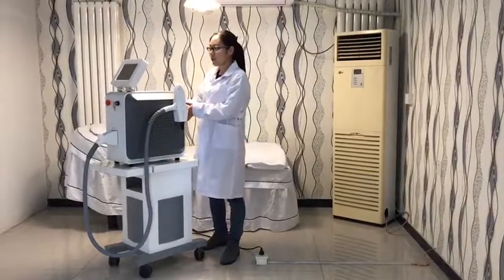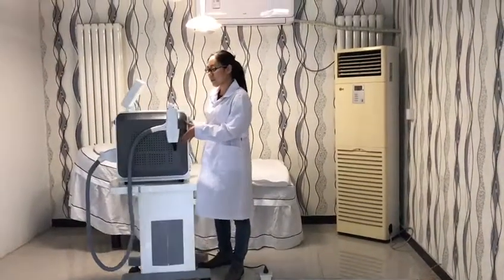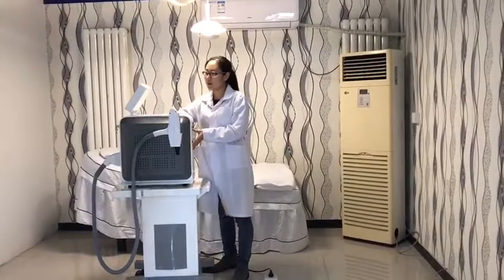Hello everyone, glad to introduce our portable NDR laser to you. Please see the appearance.